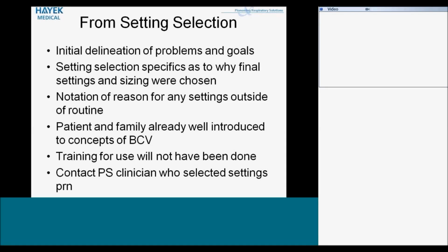And at any point in time, if you are not the person who did the setting selection, you can check in with the home office, and they can put you in touch with the individual that did, if it was a personal support clinician. You might need some additional background information on why those settings were chosen, and you can contact that individual, and they can help you out with that.